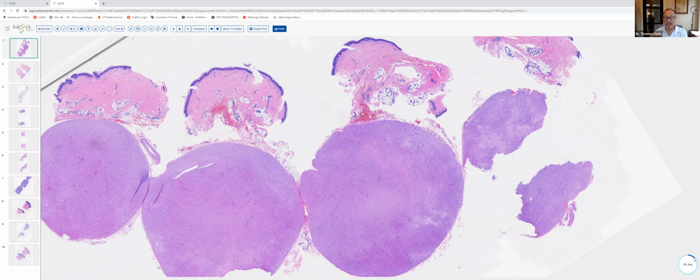The nuclei also tend to be a little tapered and not so blunt-ended. And finally, a giant cell tumor of tendon sheath can have this configuration as well, but of course, it's much more cellular and has the characteristic osteoclast-like giant cells admixed with usually siderophages and lipophages, and has a different cellular makeup.